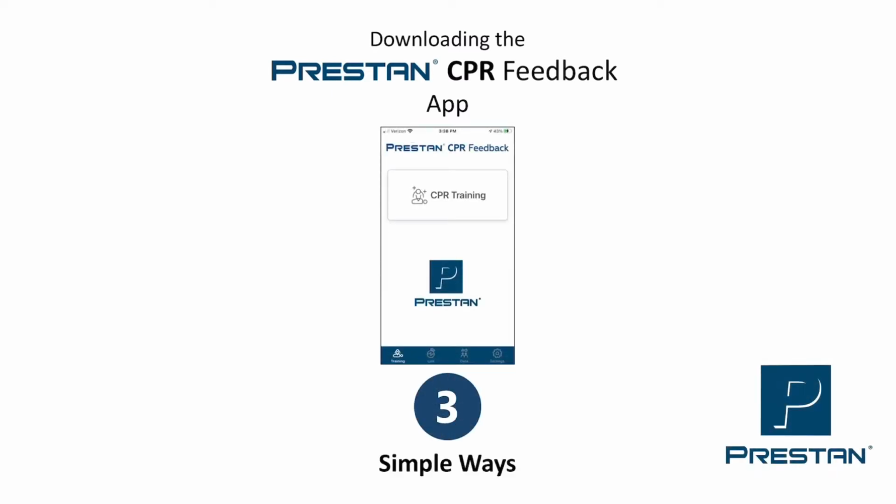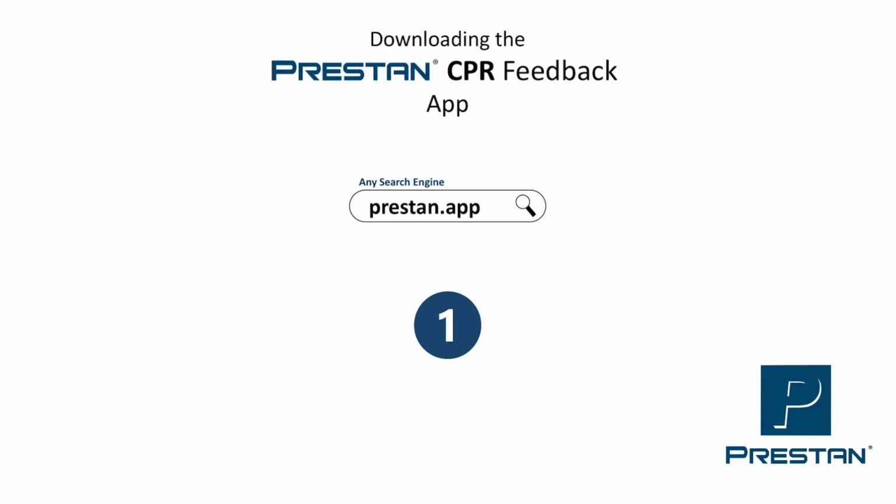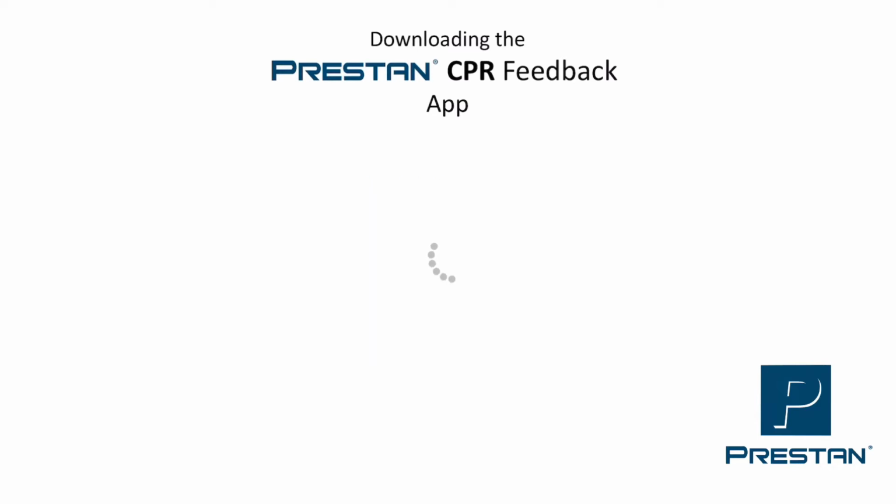There are 3 simple ways to download the PRESTAN CPR feedback app. First, you can visit prestan.app to be automatically directed to the PRESTAN CPR feedback app in the App Store for your specific device.